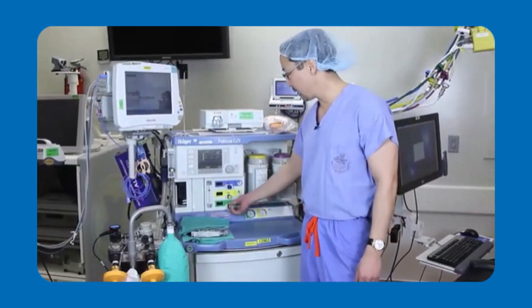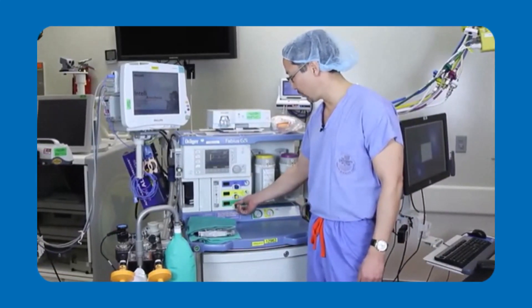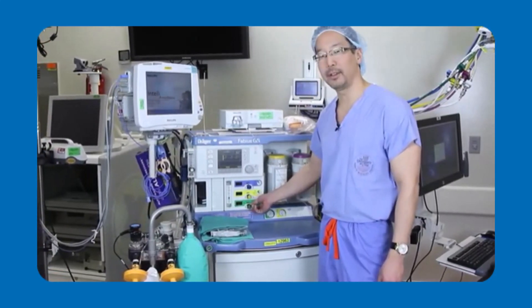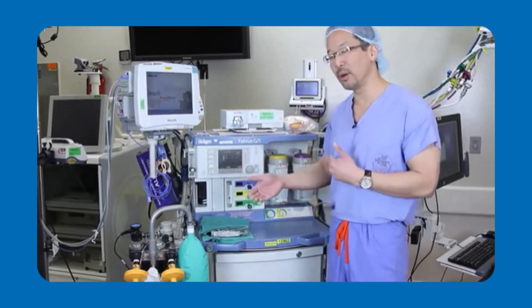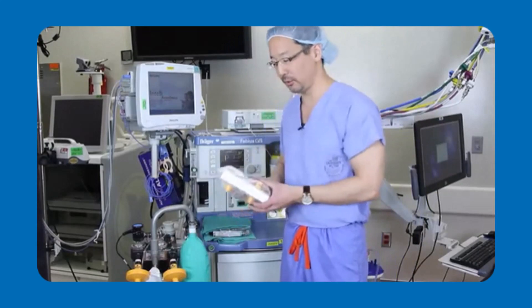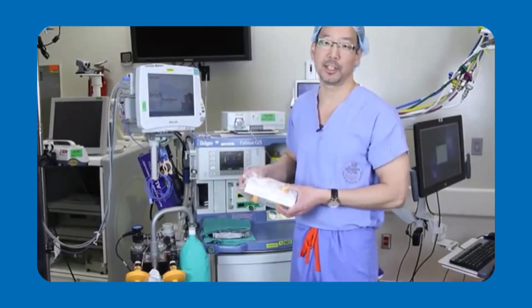With the VaporClean filters in place, I can now be confident that I can run my fresh gas flows at 3 liters per minute for up to a 12-hour case. If the case should last longer than 12 hours, we recommend replacing these filters with a new set of filters to maintain your patient safety.